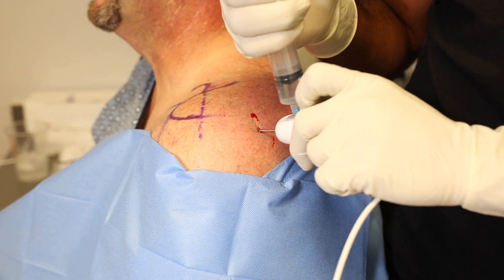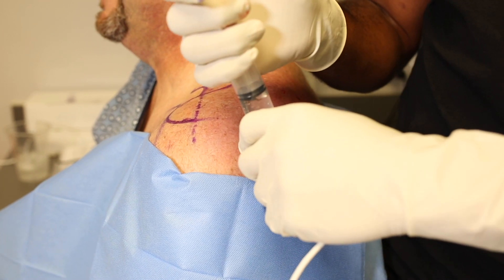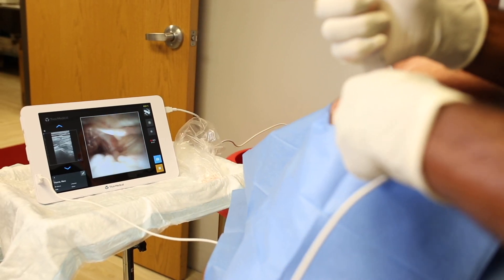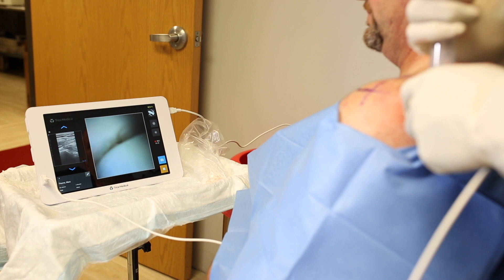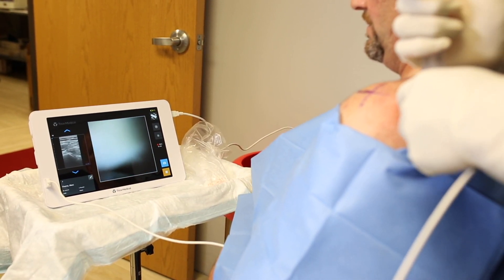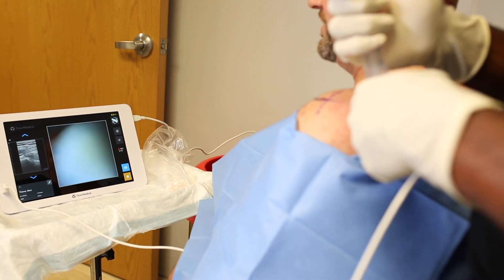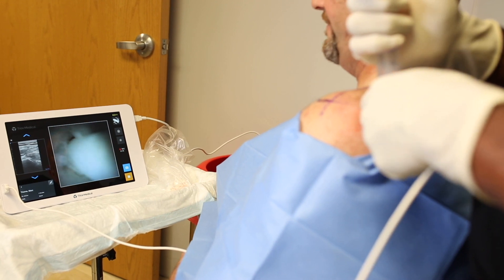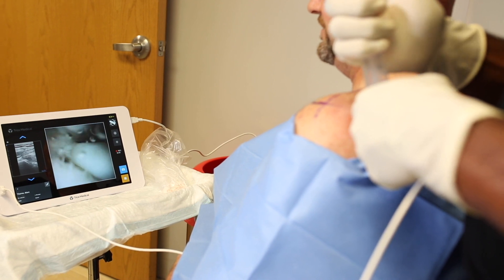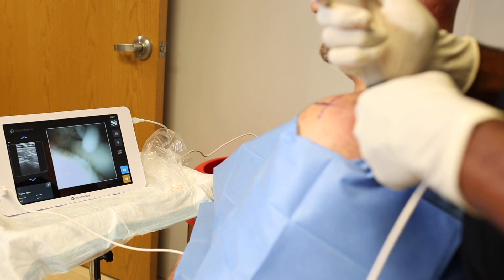The MyEye2 is now in the shoulder — we've only had to stick the patient in one place by using ultrasound. In our typical in-office setup, the tablet sits on a tray in front of the patient. I'm standing behind the patient using the MyEye2 needle scope to visualize the joint from the posterior portal. With the patient seated, they're quite comfortable, and I can ask questions and point things out as we do the procedure.